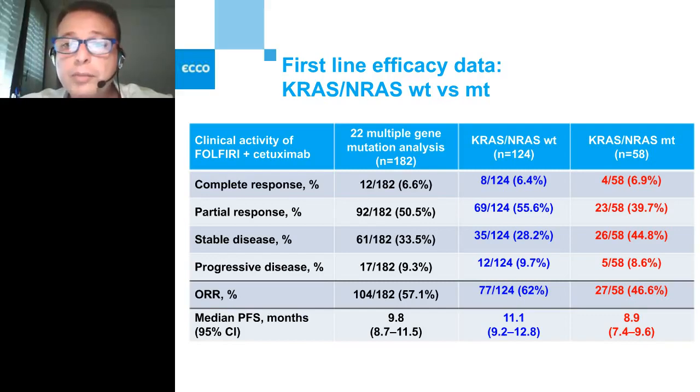In particular, we know that individuals with BRAF mutations have a very poor outcome, and also individuals with double mutation in PI3 kinase exons 9 and 20 have a very poor outcome, and we had 2 patients with double mutation in our cohort of patients. So, the conclusions of this study are on 3 levels.